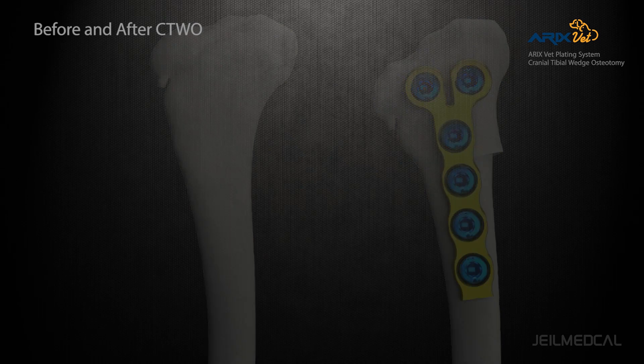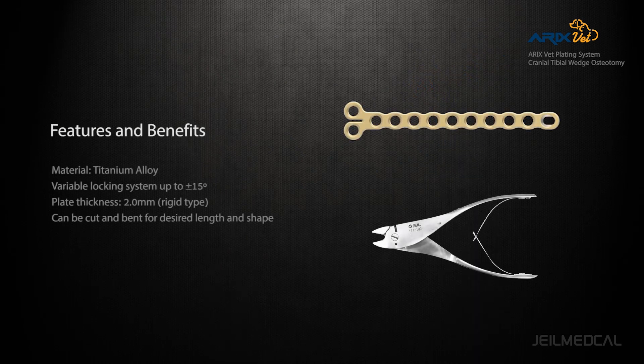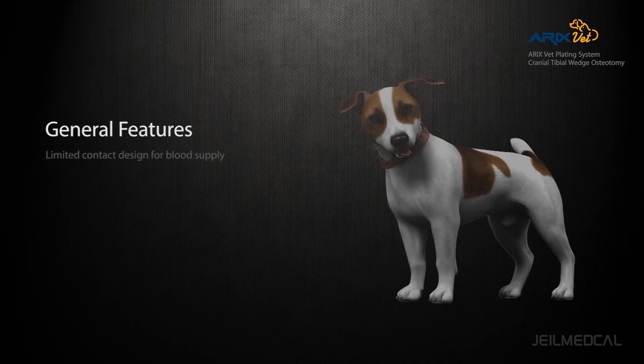The plate is made of titanium alloy for strength and limited contact, designed for better blood supply.